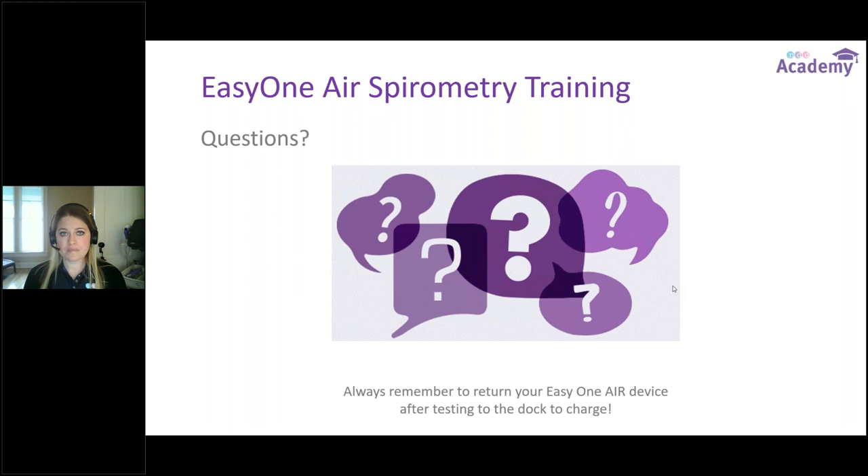Question: I connected to a computer to change the displayed parameters but it didn't change on the device once disconnected. From EasyOne Connect software, there are a couple of ways to change parameters test by test. Go into Utilities, then under the Test tab you'll see each individual test listed at the top of the table. From there, go into Parameters — one side of the screen is for what you see on the device, and the other side is what appears on the printout. We'll confirm those were put in the right place when adjustments were made.